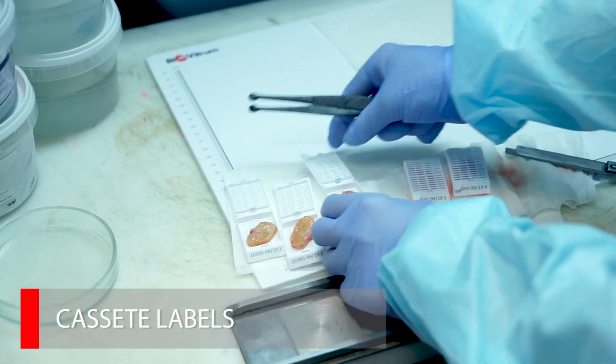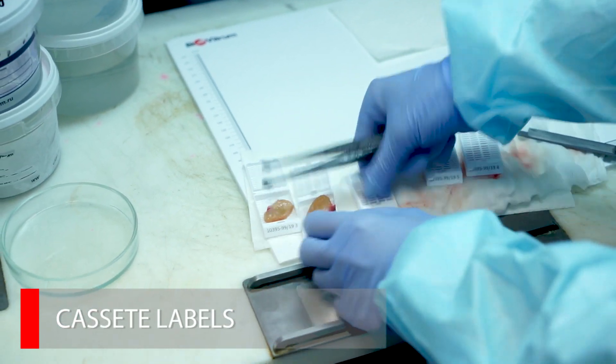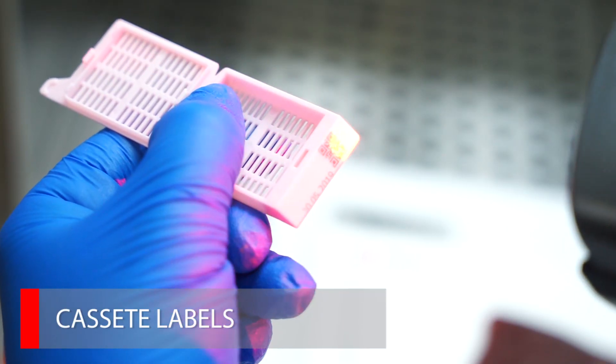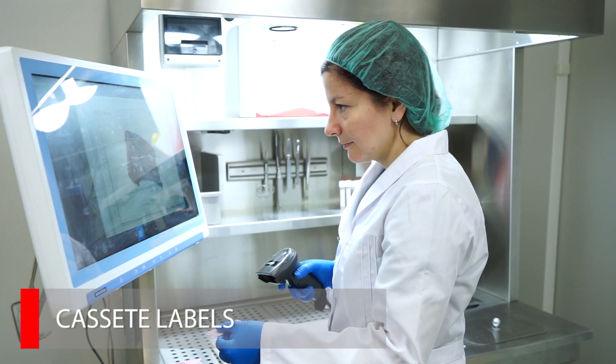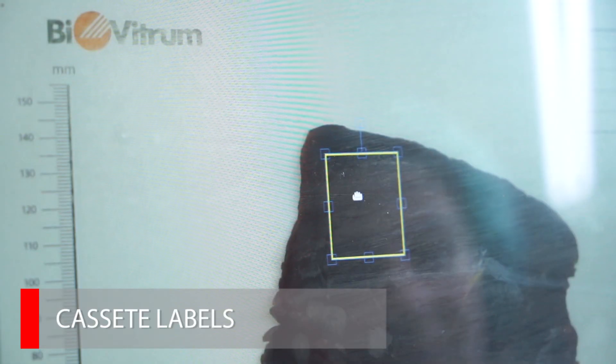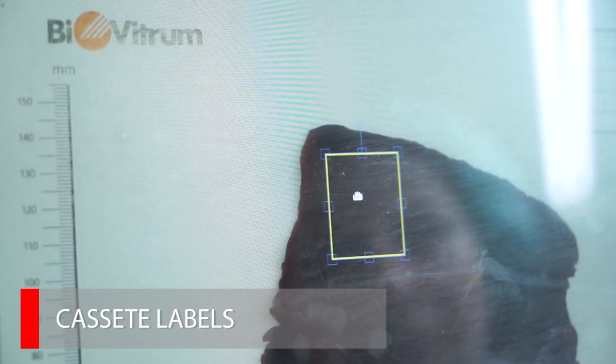During the grossing, the pathologist can apply cassette labels to the image. Cassette numbers can be read with a barcode scanner.